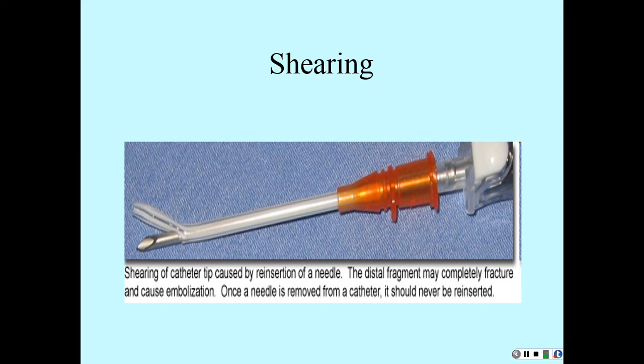It's usually related to a catheter injury at the vessel site, or it may be because your IV catheter has not been irrigated like it needs to be and flushed. Remember we talked about PICC lines, and sometimes you have 2 lumens and 3 lumens. If you're not using those, they have to be flushed every so often to keep them patent, just like your saline locks. If you've just got a saline lock in there and you're not using it for anything, you still have to flush that about every 8 hours just to keep it patent.